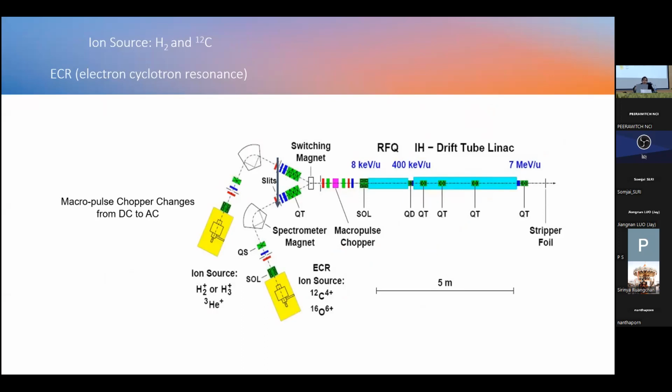In a synchrotron system, as I said, there are a lot of components, and interestingly enough, this first component, meaning your source and the LINAC, this injector that goes into the synchrotron, could be as expensive or maybe more expensive than the synchrotron itself. It's relatively hard to get a lot of protons from your hydrogen source when there's very low energy, meaning they're basically just floating there, and get that first acceleration. It's hard to get that efficiently.